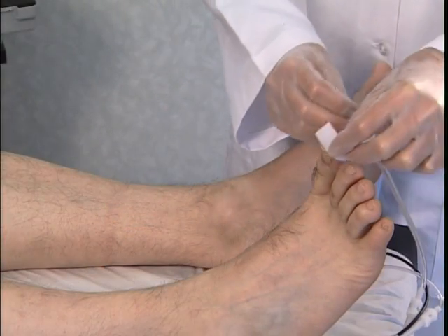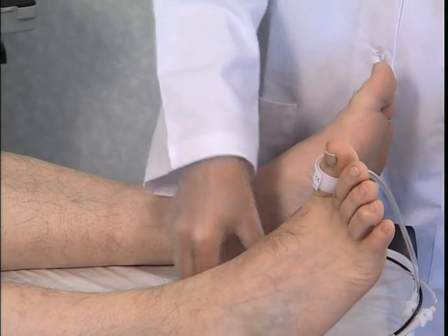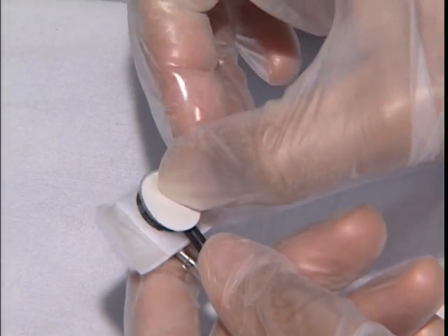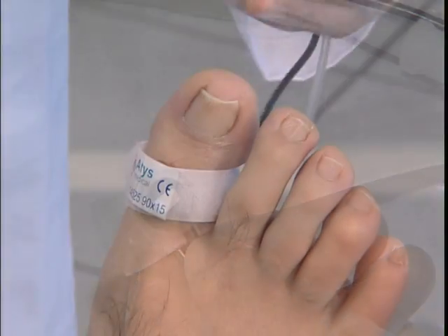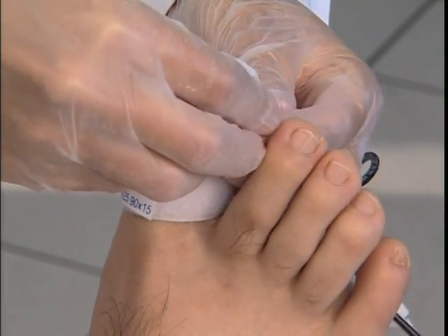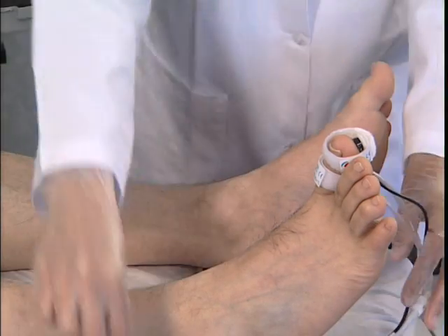Place the occlusion cuff on the proximal phalanx of the big toe. Do not over-tighten to avoid blocking the blood vessels. Stick double-sided tape onto the sensor to ensure that it is in contact with the skin when the second cuff is placed on the distal pad of the toe. The tube should be positioned towards the heel.